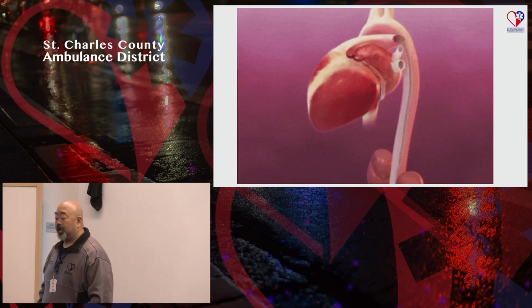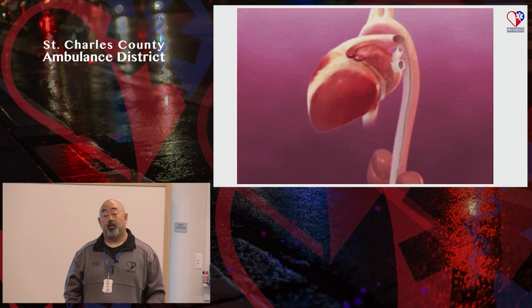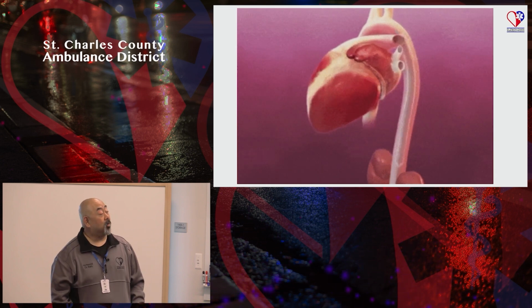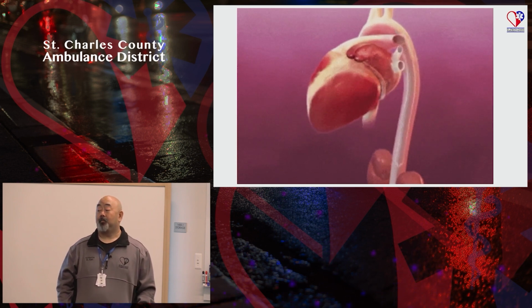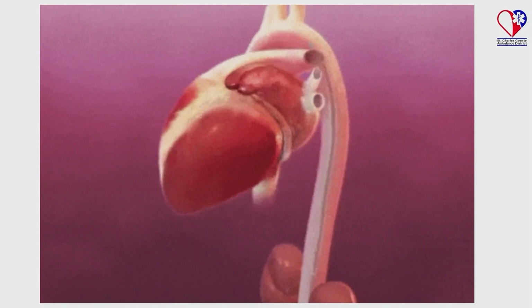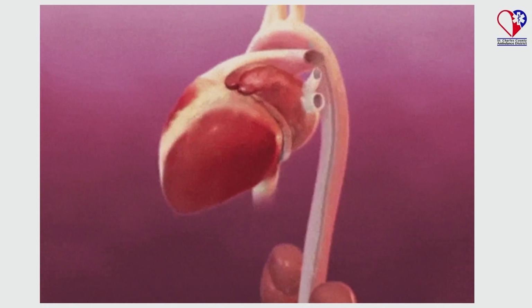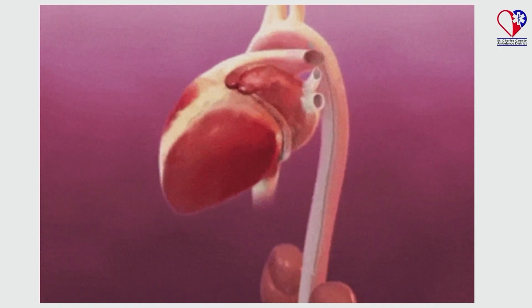So when you look at it, timing is everything, right? Can you imagine if the balloon inflated during systole? That'd be bad. If the timing is off in any way, it's not optimal. The reason why this works really well is because, if you look really closely, it's almost perfectly in sync here. This is what you're looking for. When the heart is squeezing, the balloon is also closed. And when the heart is relaxing, the balloon is also opening and being filled.